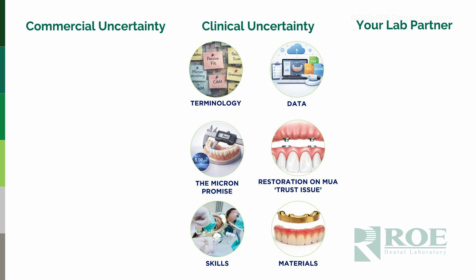In the digital ecosystem, the accuracy of the data at the start is critical. How we get off the runway is probably the most important part of the process. Just because we're sending in digital data to a dental laboratory, it doesn't mean that that can be manipulated if it's poor. If it's poor data, it's poor data. And therefore the starting point and the end result is going to be affected. So accuracy of data or records is absolutely critical, just like it is in the analog world.